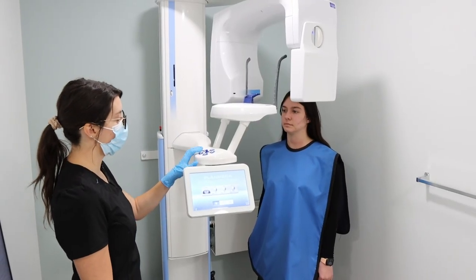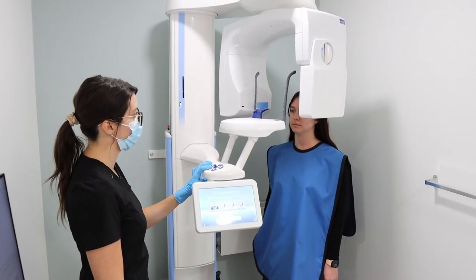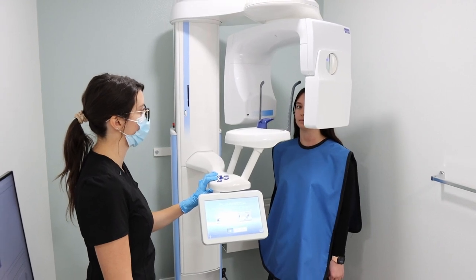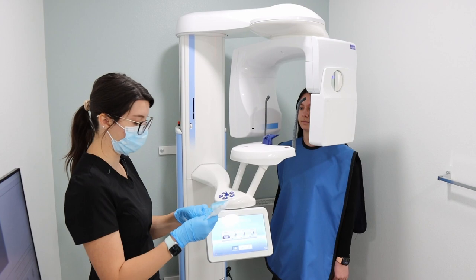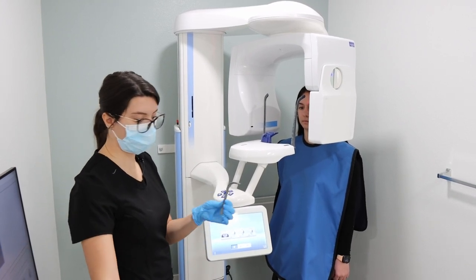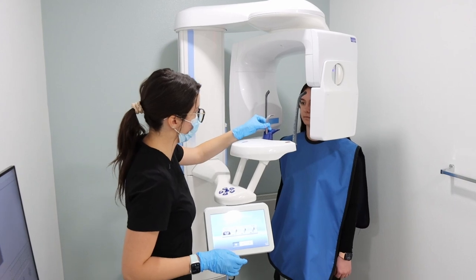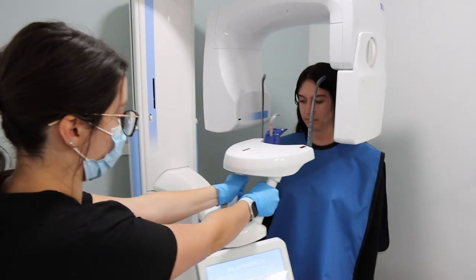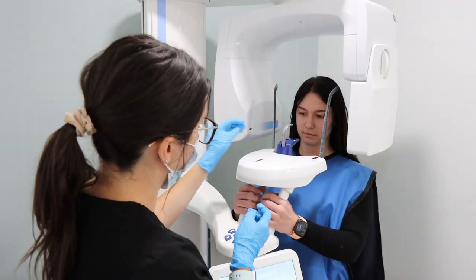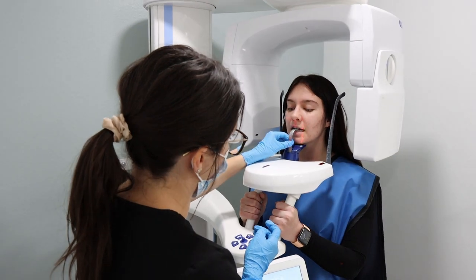You're going to lower the pano machine to the height of the patient. You're then going to take a sterile pano stick and insert it into the machine. You'll instruct the patient to step forward to grab onto the handles and to rest their chin down on the blue and bite on the stick.